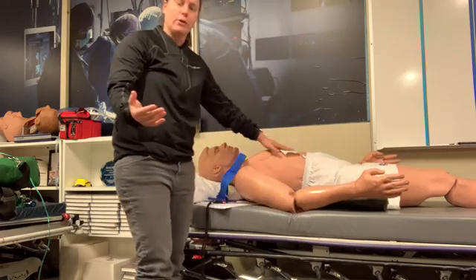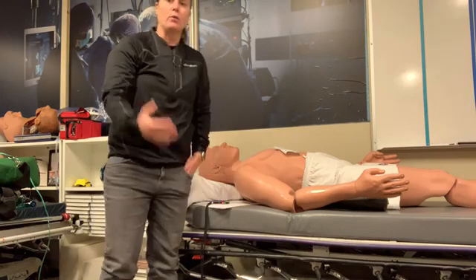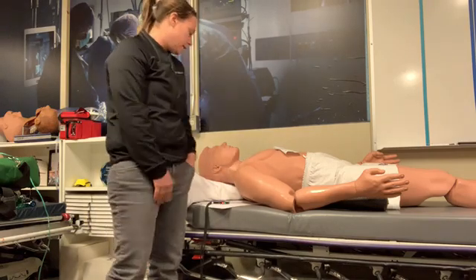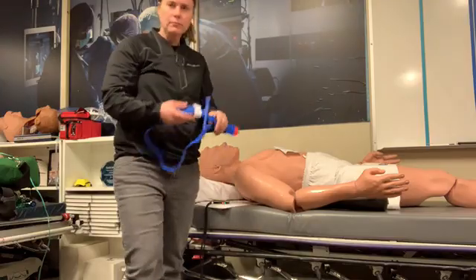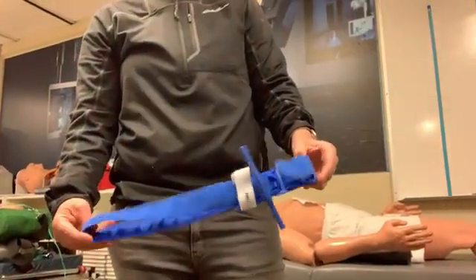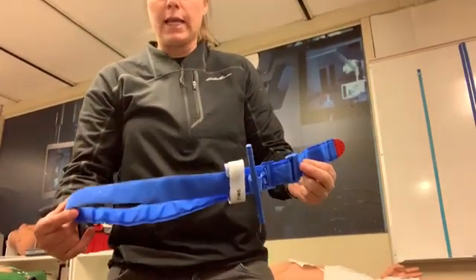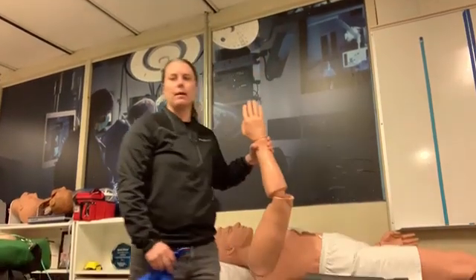The judge will then tell you that that is not working, that the wound is still bleeding, and that you're waiting on EMS to get there. They are delayed. So you are going to need to use a commercial tourniquet. This is a CAT tourniquet. This is a style that will most likely be available to you to use. And the judge will tell you where and how we're going to put this on. So this is a mannequin. You can put this on the mannequin arm.